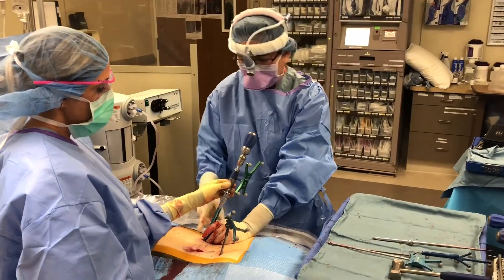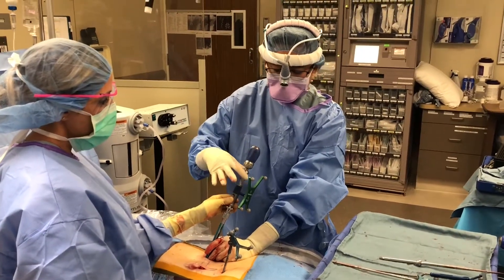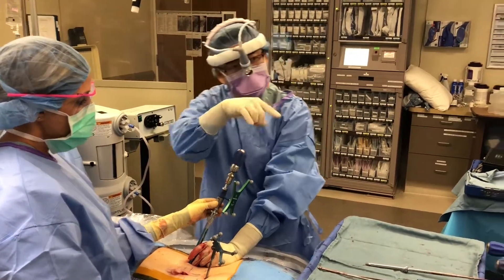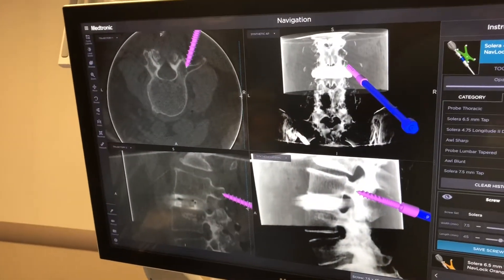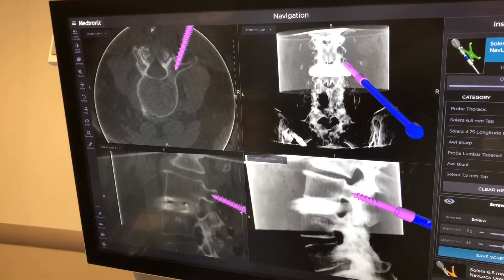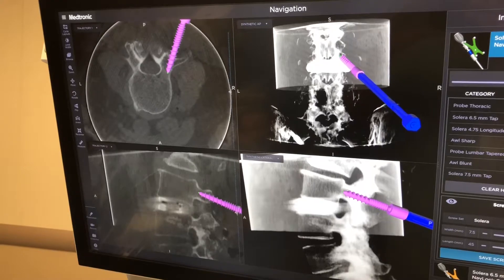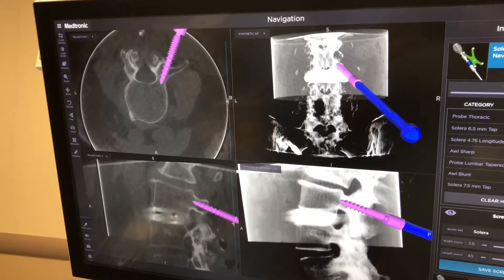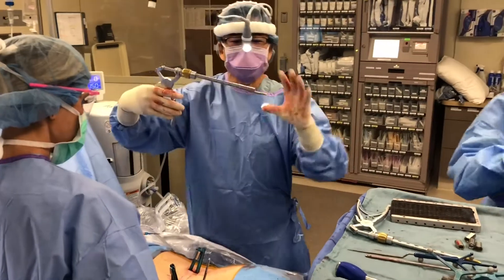We're putting in the screws now. This is the screwdriver — I already have the screw inside the incision, and this is the navigation tracking frame. You can look up on the screen now and see that I'm live imaging with navigation. It's really like cheating, but I can see the whole thing going in, start to finish, with imaging on the whole time.